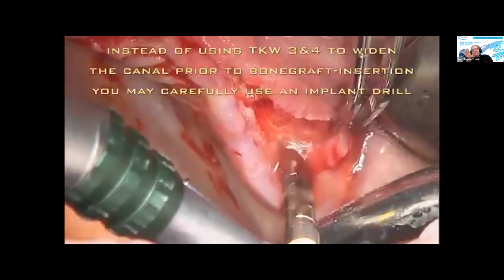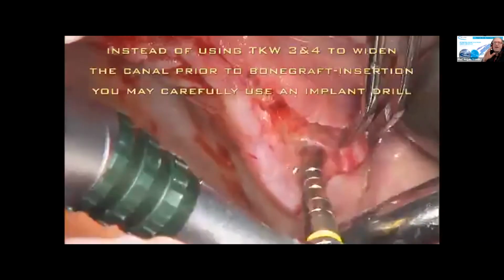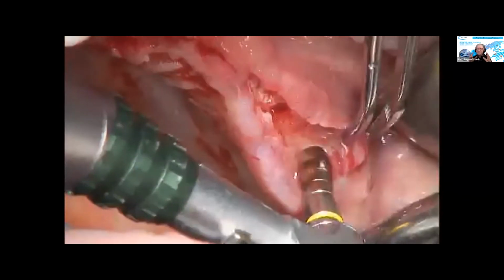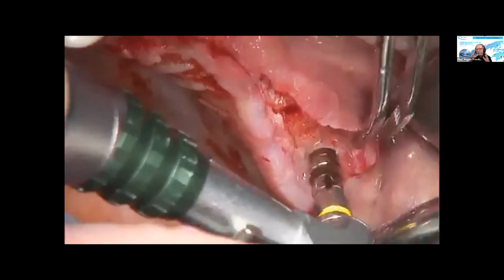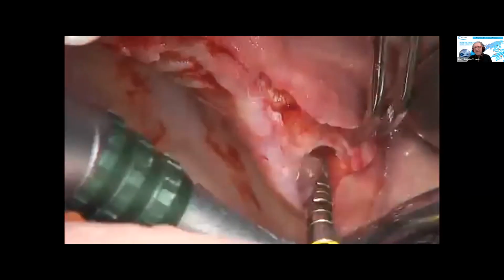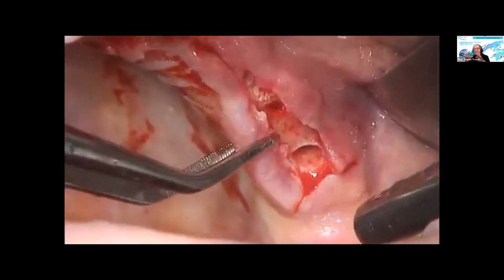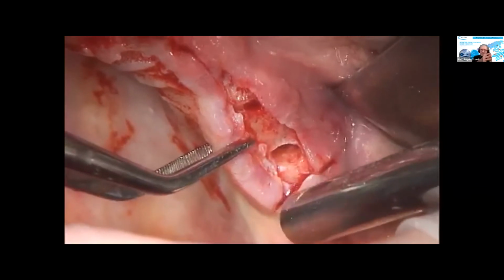Mostly I use the TKW2 tips for preparing the site for the implant, but in this case, we take a wider diameter because the diameter of the TKW4 tip is 2.8 millimeters. This would be too narrow for this almost 5 millimeter diameter implant. So, of course, we use the drill, and every implant system has its own philosophy. So you have to use the final drill for your specific implant system.